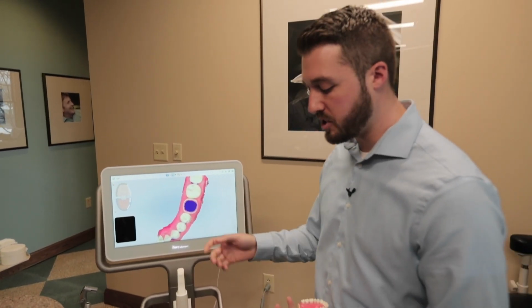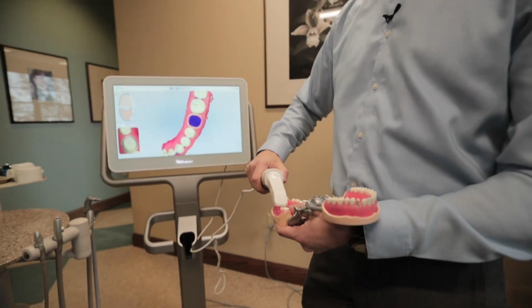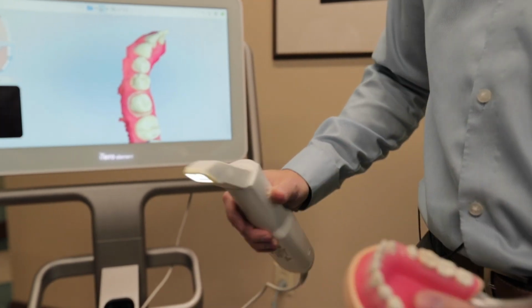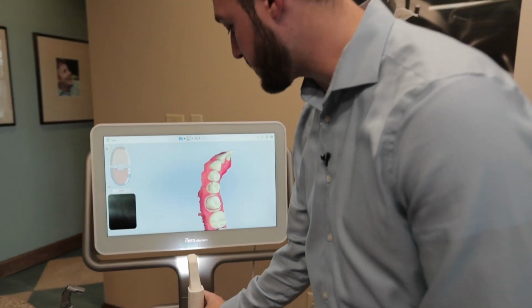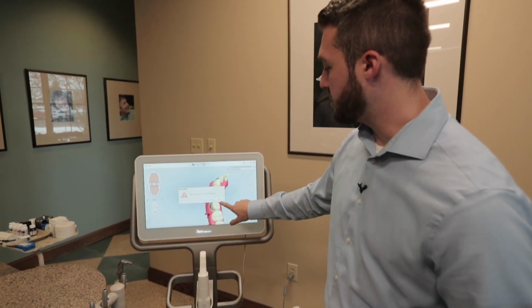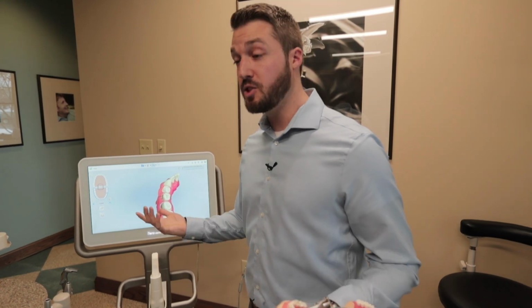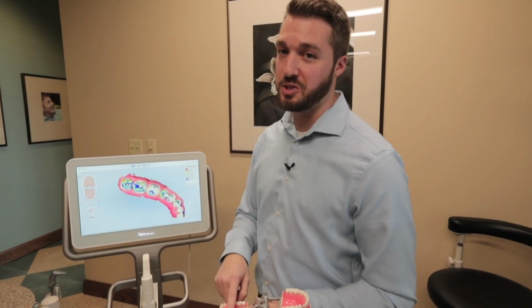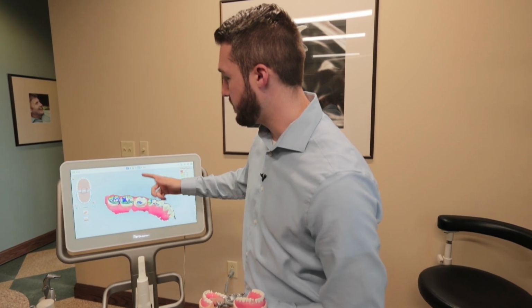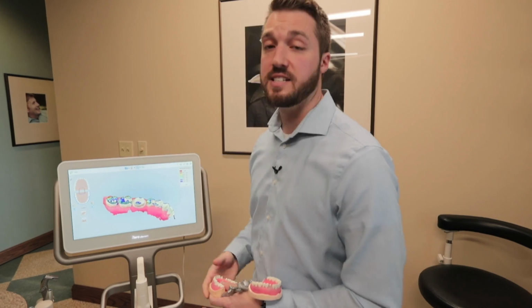So now we could go ahead, touch it up with a burr, and now we could capture that new height. We simply turn the scanner on and capture that new height. Within a couple of seconds here, we're able to literally reimpress that patient with the new height. All right, we're then going to go ahead and add it to post-processing. It's telling me that I should take another bite scan, because, again, you should take another bite scan, but we didn't touch it with a burr, so it's not going to allow me to do it. All right, and then from there, we'd be able to hit the send button and send it right off to the laboratory.